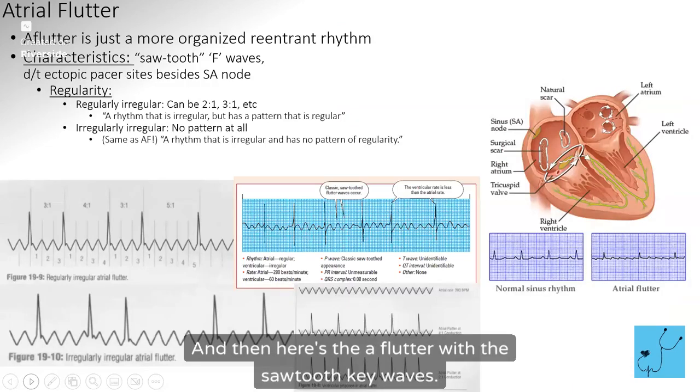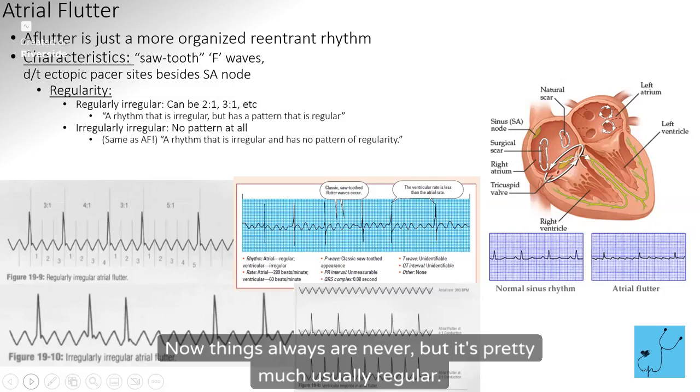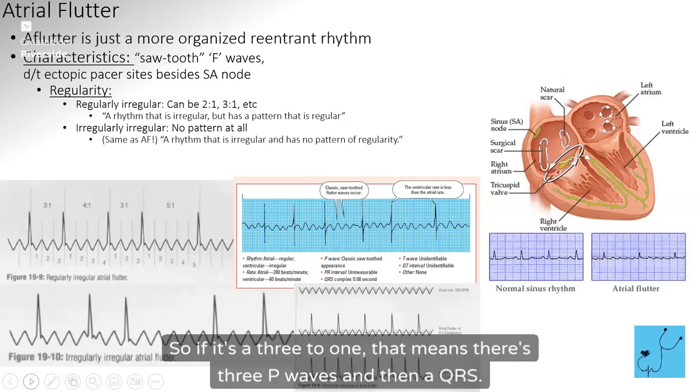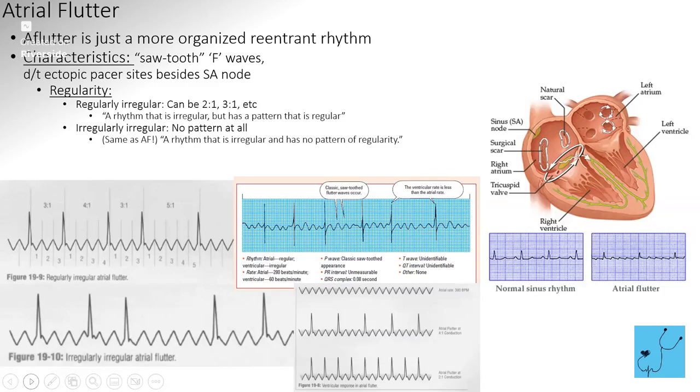And then here's the A flutter with the sawtooth P waves. It's usually pretty regular. Nothing is always or never, but it's pretty much usually regular. And you'll hear people saying this is a 2-to-1, a 3-to-1, a 4-to-1, whatever. They're just counting the P waves and giving it a number. So if it's a 3-to-1, that means there are 3 P waves and then a QRS. That's all that means. A lot of times you can't see the T, all you see are P waves and QRSs. So, like 1, 2, 3, 4, this would be a 4-to-1, 1, 2, 3, 3-to-1. So we're counting the P waves.